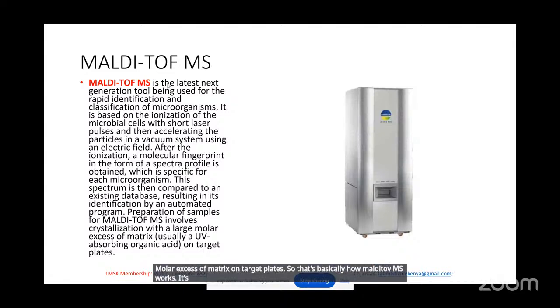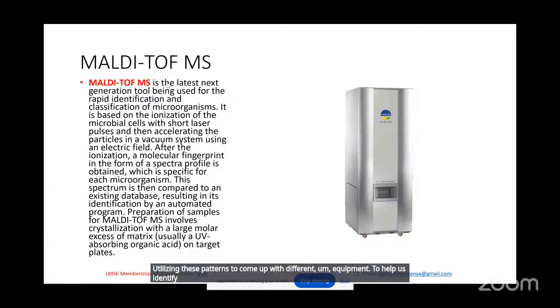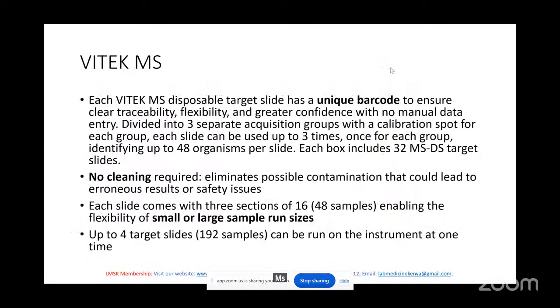It's a patent, and you'll find different manufacturers utilizing these patents to come up with different equipment to help us identify bacteria. So on your right, you'll see the Vitek MS equipment. So Vitek MS uses MALDI-TOF MS. So let's talk about Vitek MS.